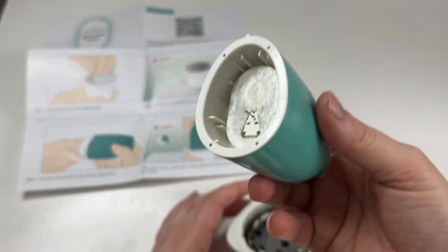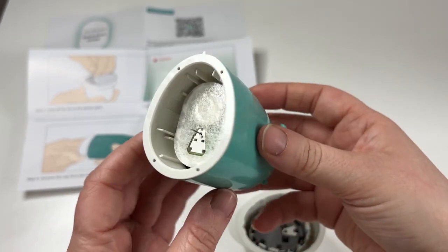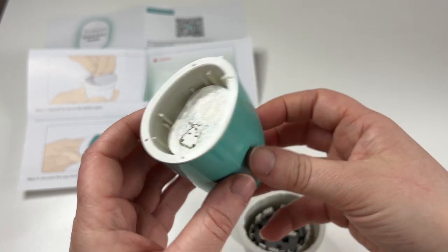Look at that needle! Why do they show the needles? It looks kind of scary but they all look like that, so I'm not going to hold anything against it right now — but look at that, ready to go.